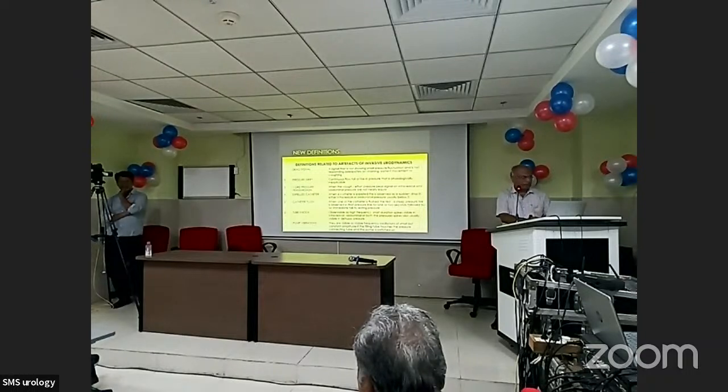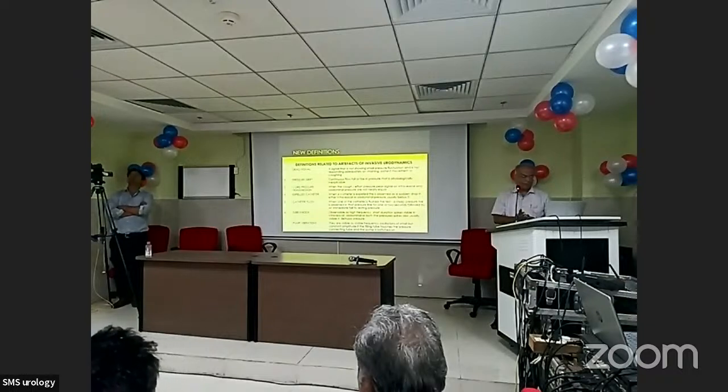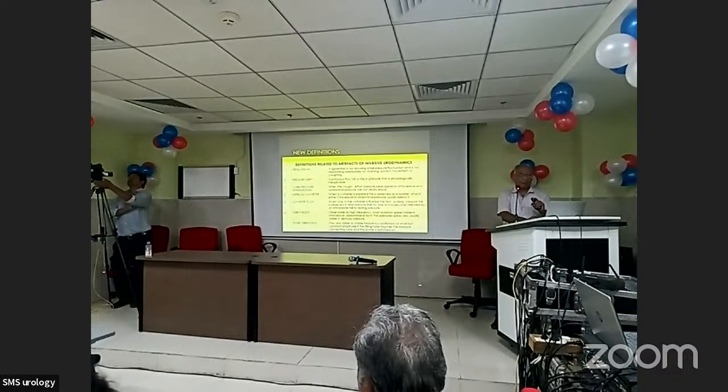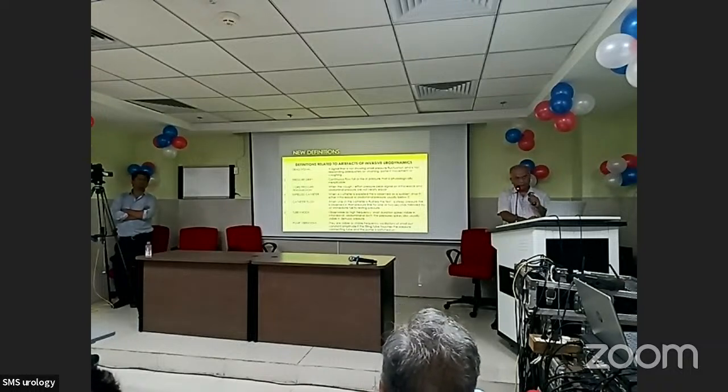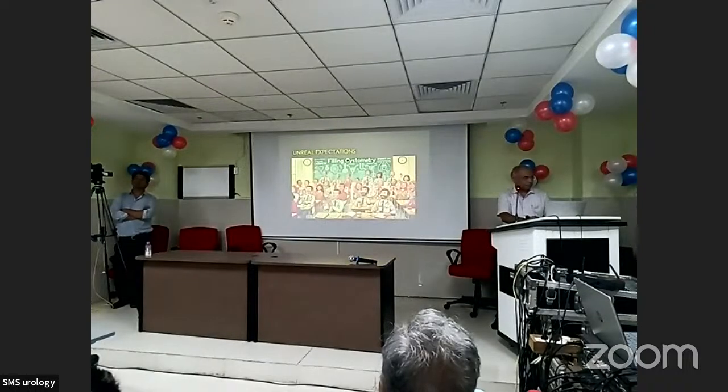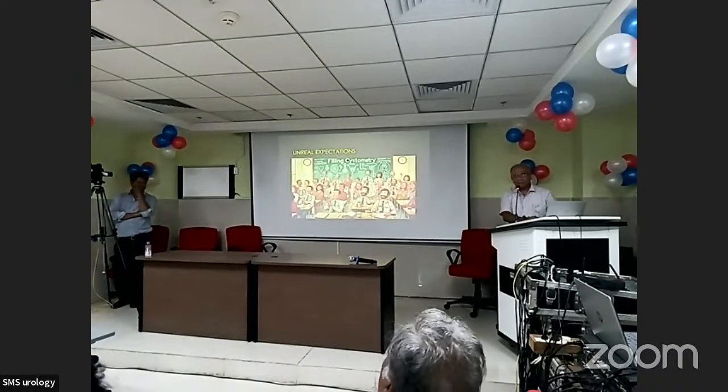Expelled catheter, that event is to be documented. Then catheter flush. Usually we would pause the study if we need to flush at any point of time. If it is there on the graph, we have to mention it. Then tube knock or pump vibration. Sometimes the tube is in contact with the pump and there are regular vibrations, which are oscillations documented on the graph. That we need to tell, because the person who is reading doesn't know all these intricacies during the study. That's it.